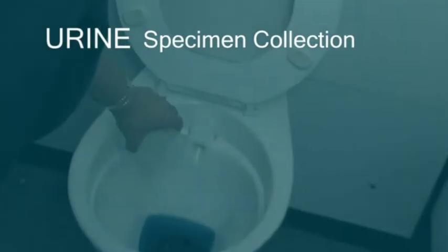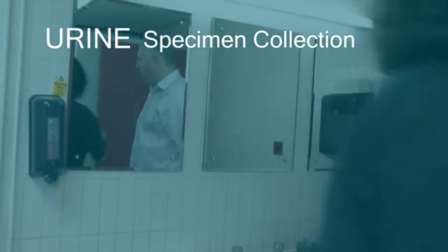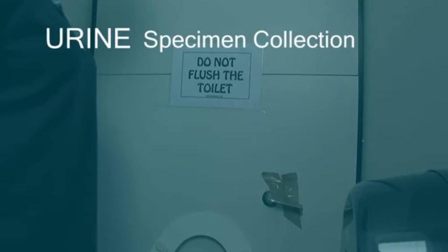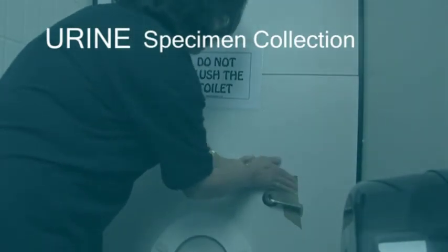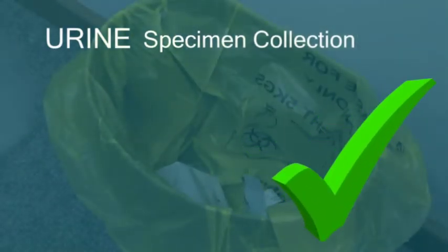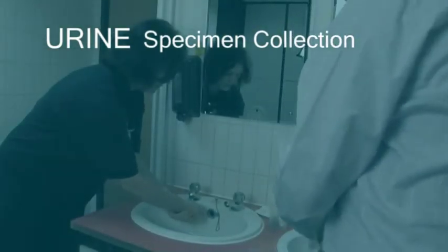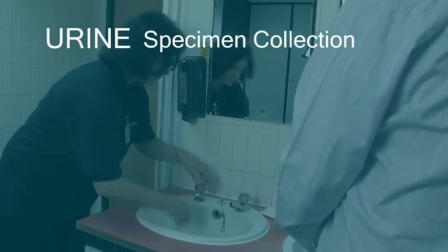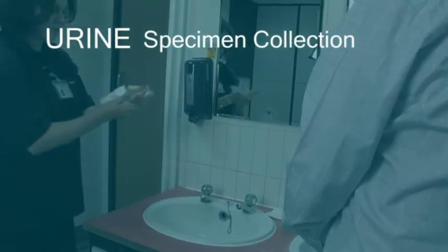Disposal of any surplus urine must still be witnessed by the donor, even if this means a return to the toilet area, and take this opportunity to ensure that all your security tapes are intact and that the cubicle looks undisturbed. Put the used cup in an appropriate disposal bag, not in the nearest office waste bin. Washing your own hands must be accommodated as local circumstances dictate. If you use a hand cleaning gel, it must be alcohol-free.